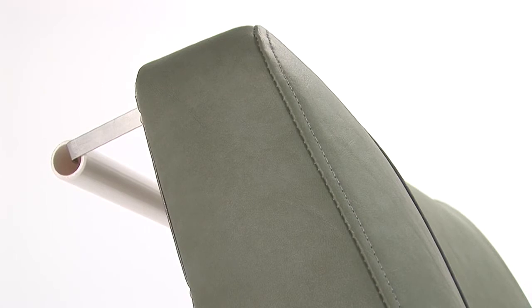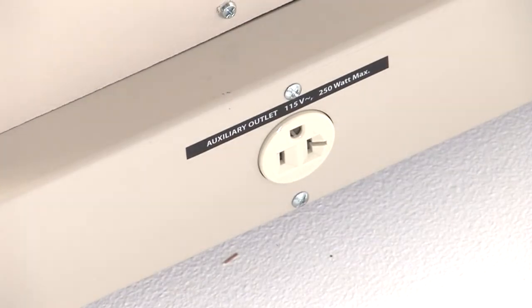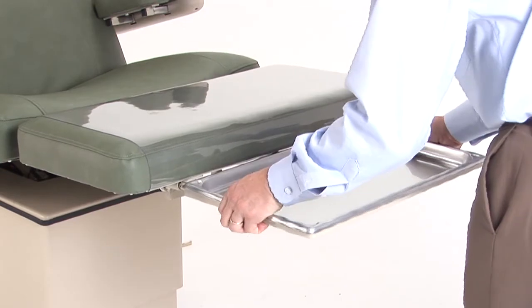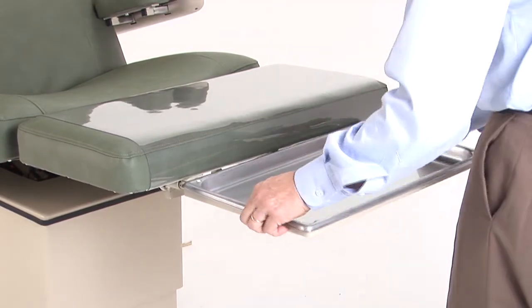The chair also comes equipped with a paper roll bracket attached to the underside of the liftback and an outlet located on the table base. If a debris tray is required, this optional feature plugs into the foot section and can be easily removed from the frame holder.